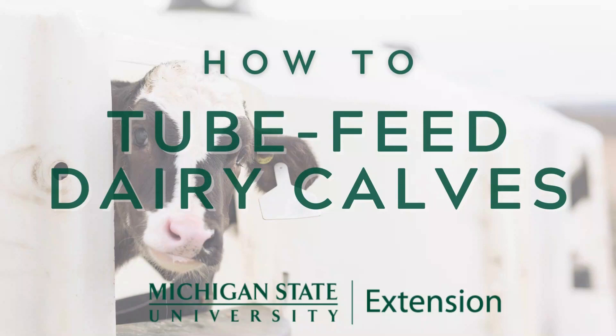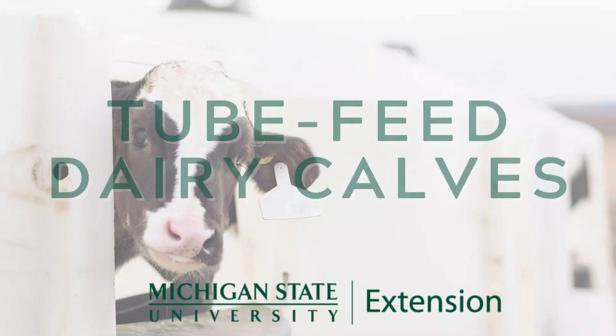Hello and welcome to this session of how-tos with the MSU Extension Dairy Team. In this video, we will show you how to properly place an esophageal tube feeder in a calf.